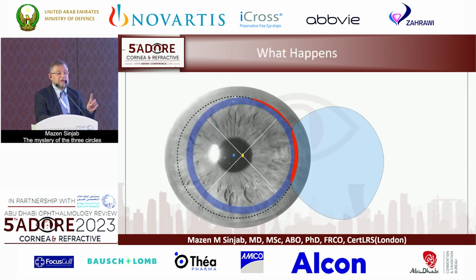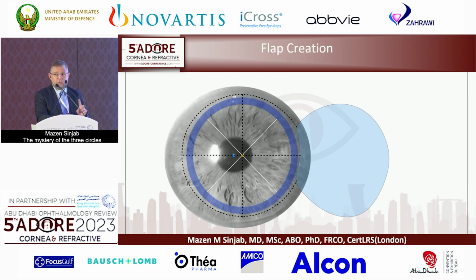So what happens if we create the flap centered with the limbus or with the pupil center, and we shift the laser profile to be with the visual axis? So in this case, as I mentioned, the ablation profile will go out of the bed and it will hit the hinge. And of course, it's not something good to just protect the hinge because we are anyhow losing energy and the ablation is asymmetric. So we have to do decentration of the flap creation itself with the visual axis.